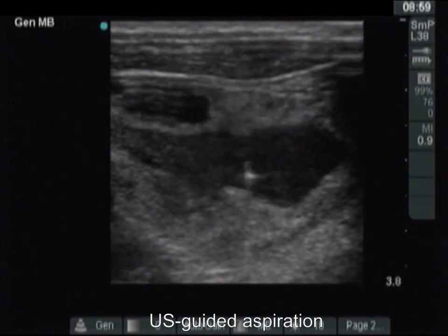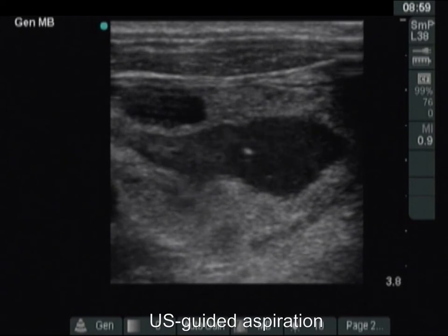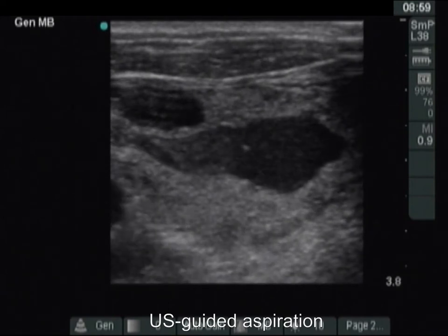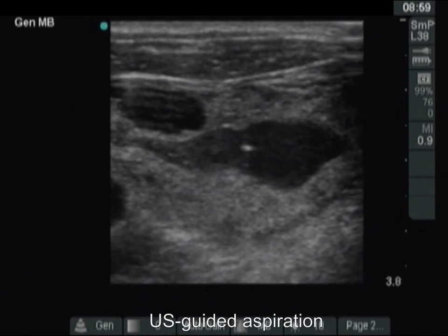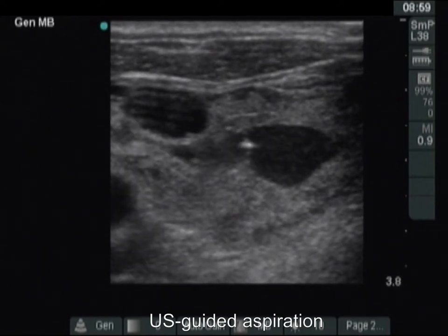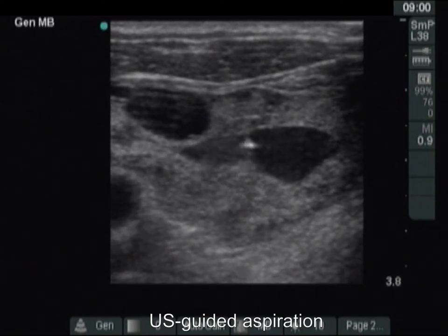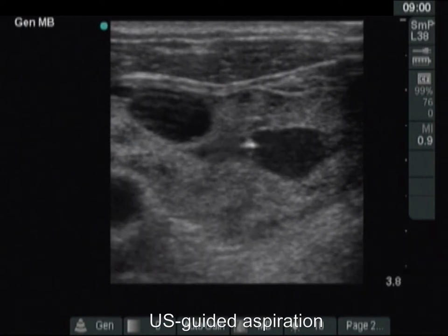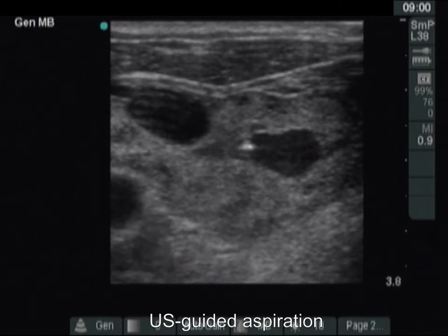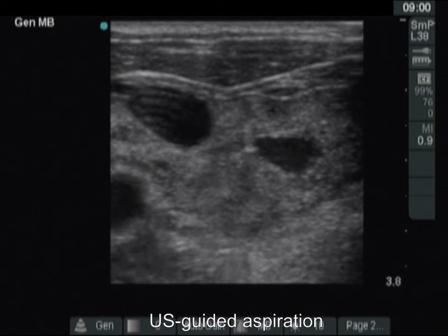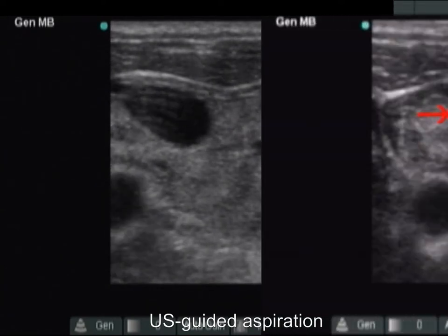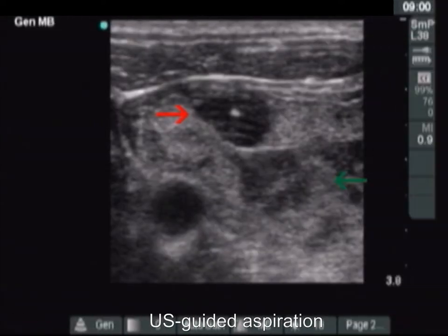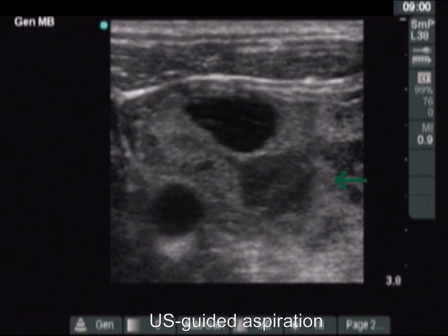The stream of blood flow is presented during the next puncture. As we can observe, the cyst has partly recurred within 30 seconds after the first phase of the evacuation. There is a small vessel within the solid part dorsolateral, left and behind the needle. This vessel causes the cyst to recur while we try to empty the lesion. The red arrow points to a cystic part, while the green arrow points to a moderately hypoechoic portion which will increase during the aspiration of the cystic area.